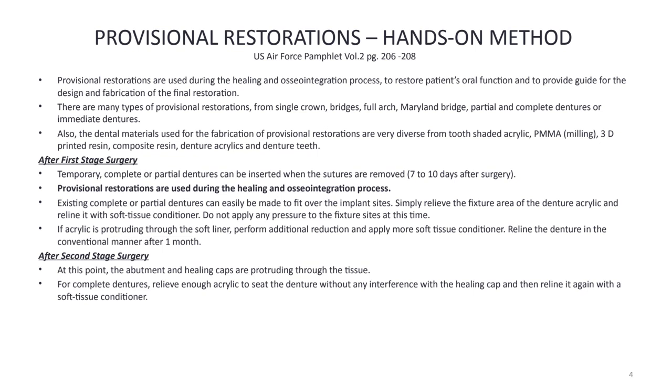If the denture needs to be realigned because after the surgery and during the healing process the gums are going to shrink, it's indicated to do a reline procedure again using harder acrylic after a month, when the tissue or the gum is more stabilized.